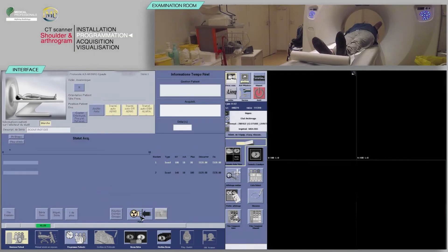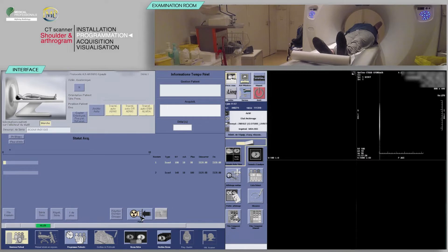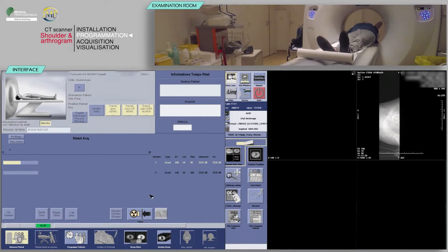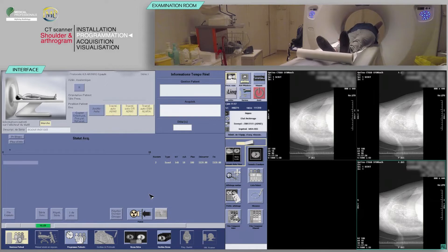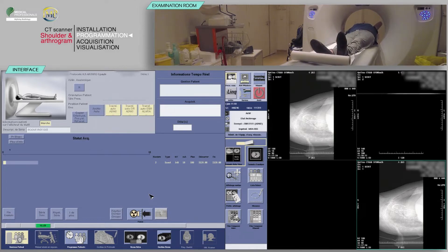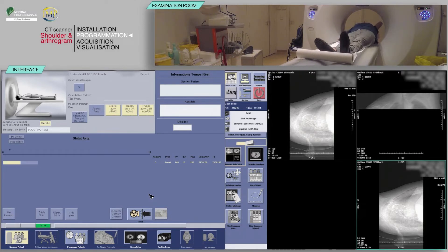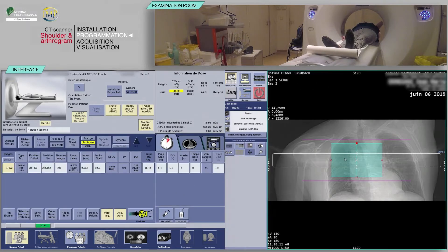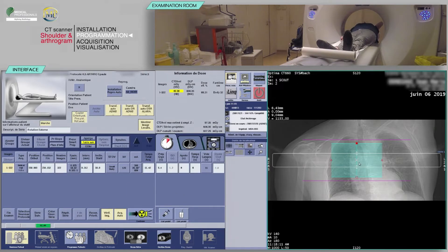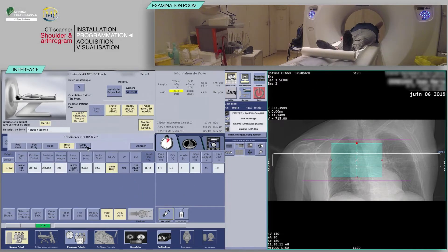On the keyboard, move the table and scan when the buttons flash. Repeat to obtain the lateral view. Click on Next Series. Unless indicated otherwise, the field will only be required over the shoulder of interest.